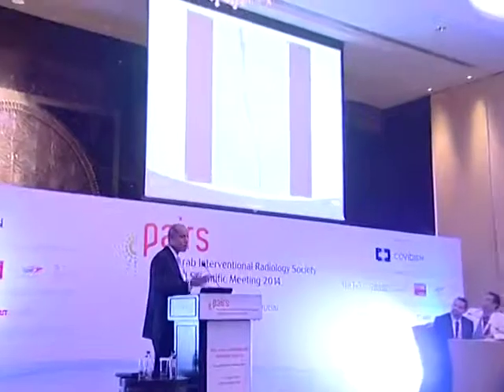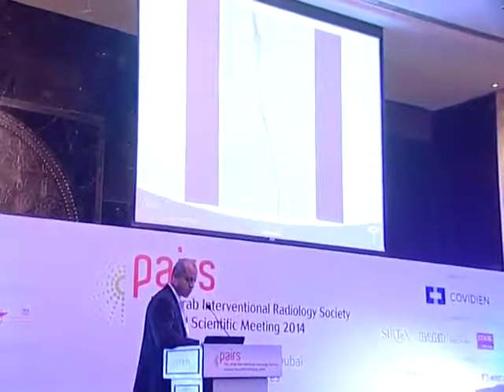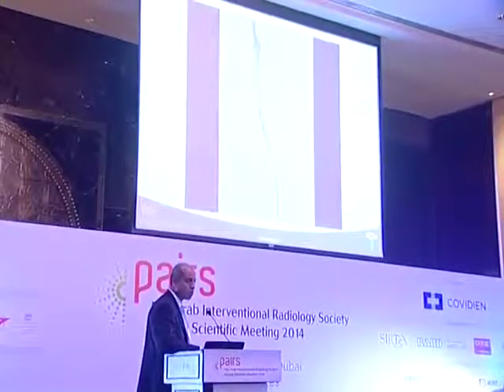Absolutely. The point, though, is that at least at the end of the initial procedure, there wasn't this AV fistula that we're seeing here. You know, it's not uncommon to have those AV fistulas after you open these vessels, especially when you are in the subintimal space, but often a prolonged balloon inflation or the stent itself would heal it.